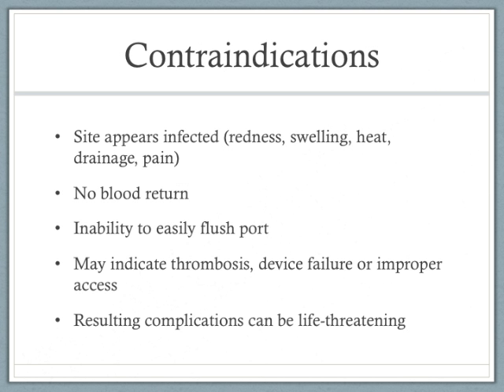Some contraindications to either accessing or using a port are when you look at the site and it appears infected. Those could be redness, swelling, heat, drainage, or pain reported by the patient. You also should not use it if you have no blood return, if you're unable to easily flush the port. These could indicate thrombosis, device failure, or improper access. The complications resulting from that could be life-threatening.